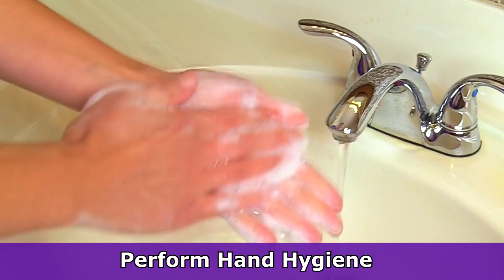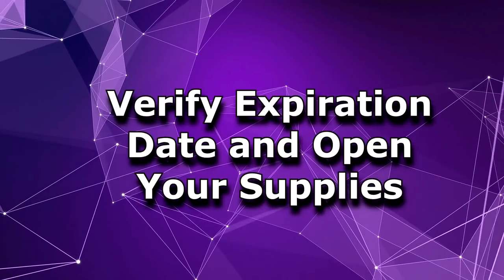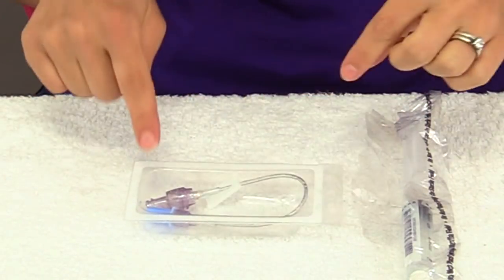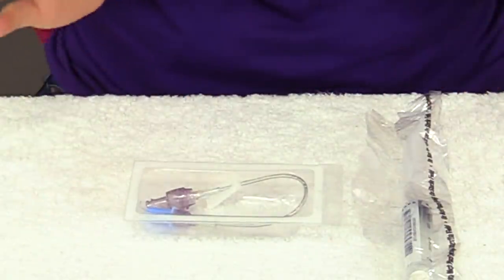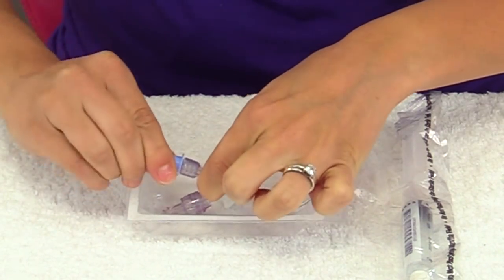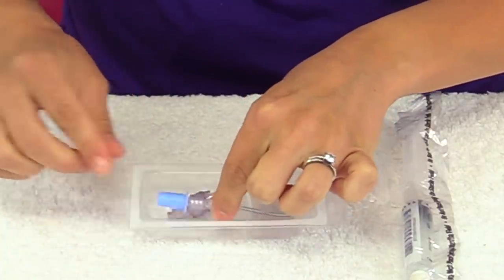So first, you want to perform hand hygiene and then you can open up your packaging. Here I've already opened up everything. The first thing I like to do is undo the little cap that's on the extension tubing, because whenever you're starting an IV you only have one hand to really work with. I like this little cap at the end to be loose because it's really on there — so I just loosen it up and then slide it on there.